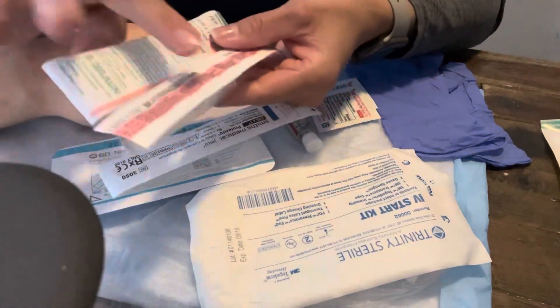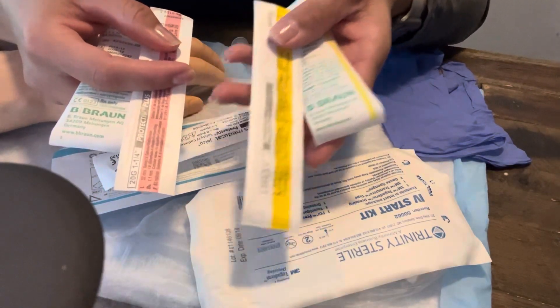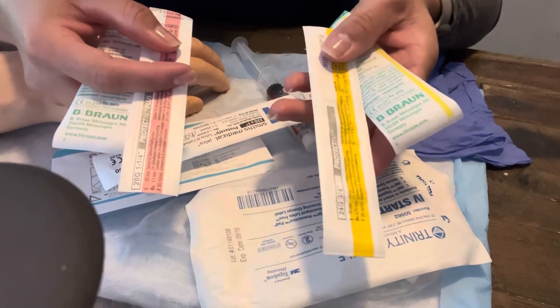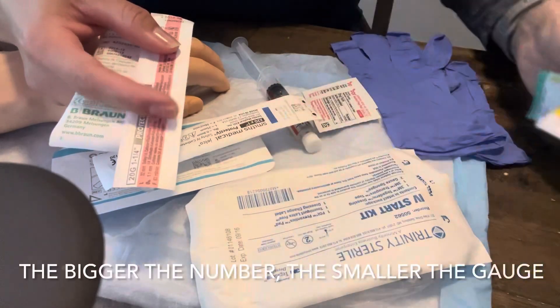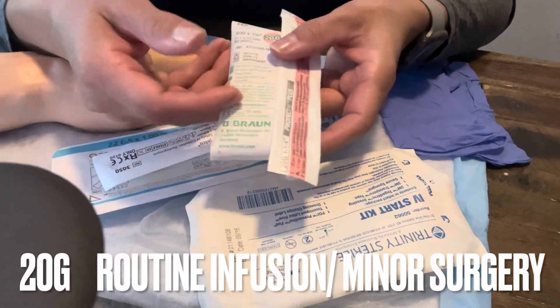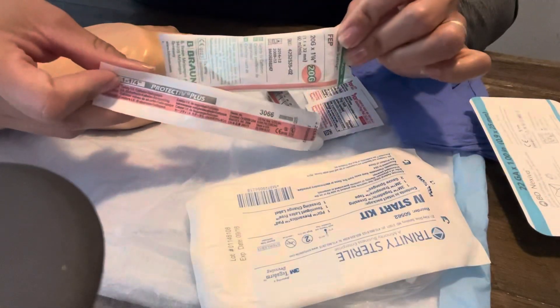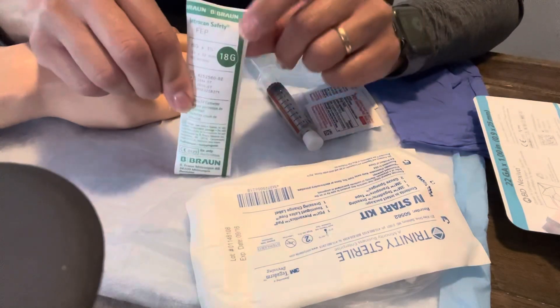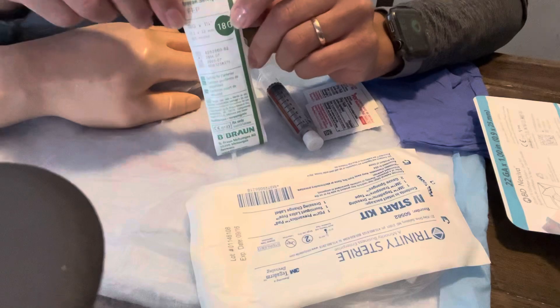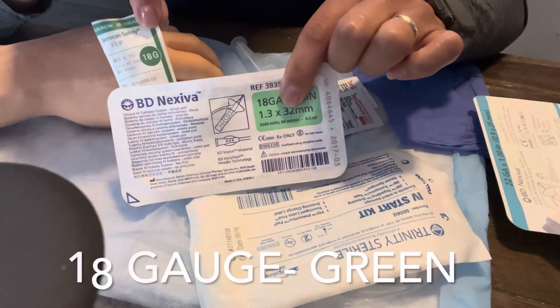Knowing that different colors represent different gauges: I would use a yellow (24 gauge) for a pediatric patient because it's smaller. With IVs, the bigger the number, the smaller the gauge. So 24 gauge for a pediatric patient, 22 gauge for a geriatric or med-surg patient, 20 gauge for adult patients. There's also 18 gauge — a bigger gauge, typically for trauma, infusing blood, surgeries. Color coordinating: greens are 18.